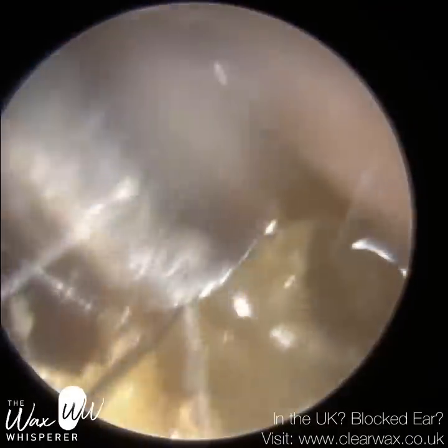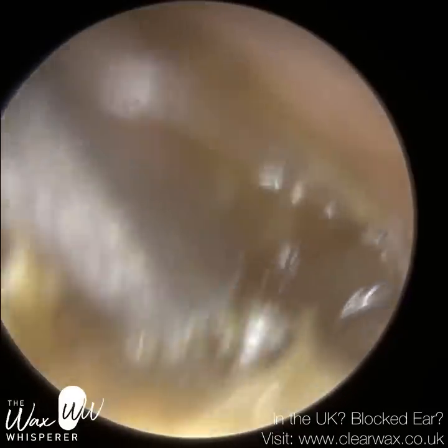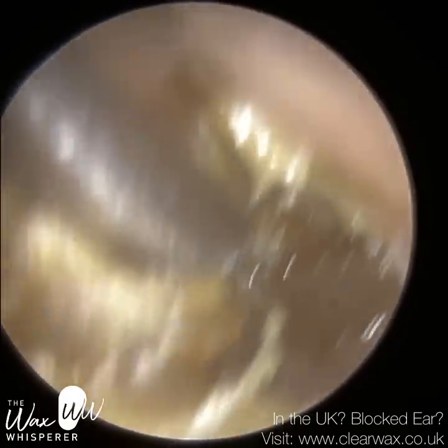Because of the sticky nature and consistency of the wax and dead skin, I've just instilled some medical grade olive oil spray. The particular brand that I use, it's called Clear.